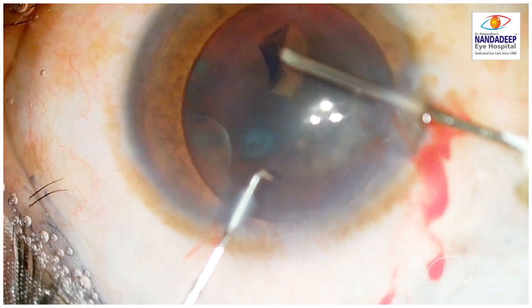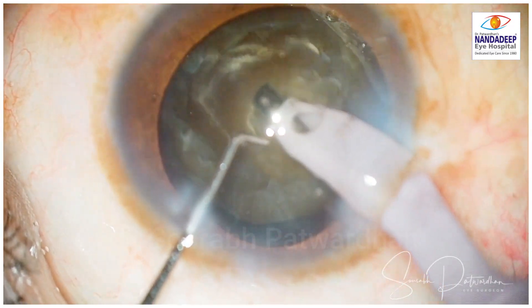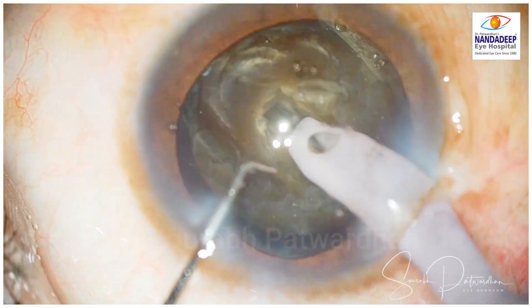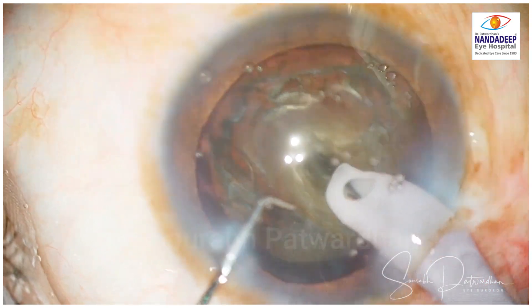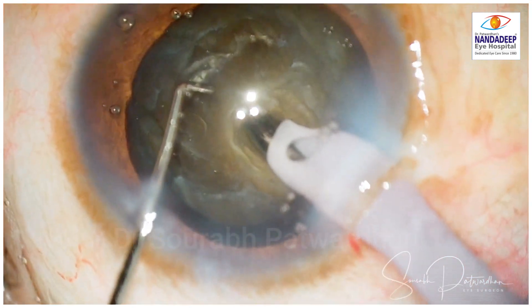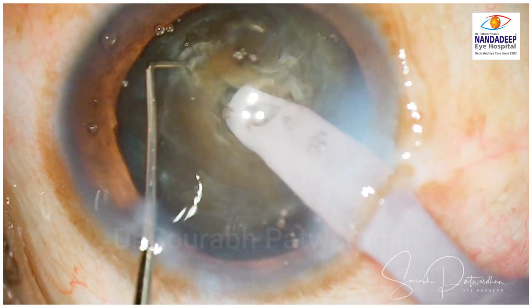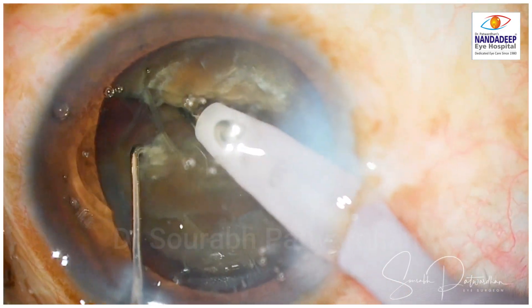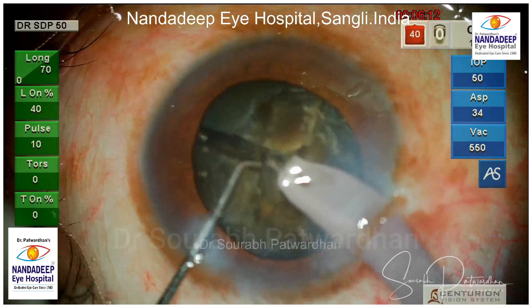I am going to use the Centurion Gold FECO machine which has active fluidics. My standard technique here is to do a half-trench using the torsional FECO. I use around 70% continuous torsional energy and then go ahead with the chops. You can see that this nucleus is not only hard, it is also sticky.